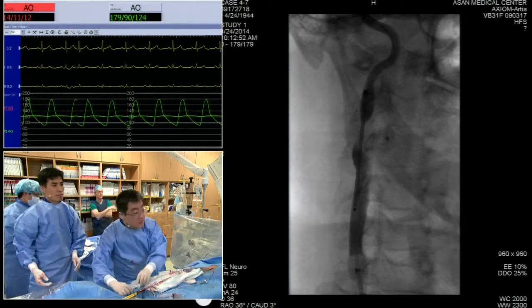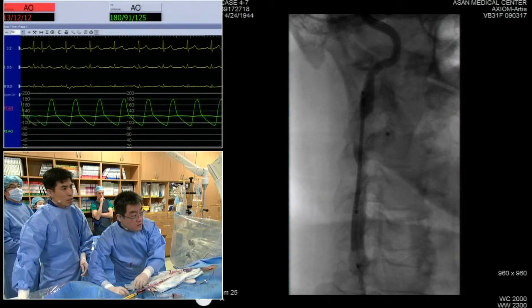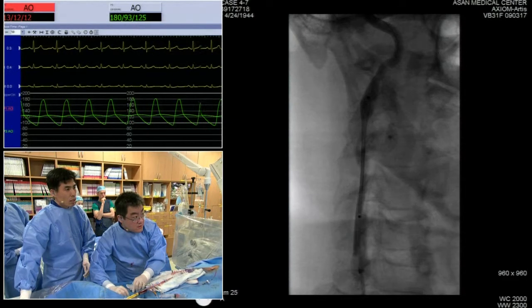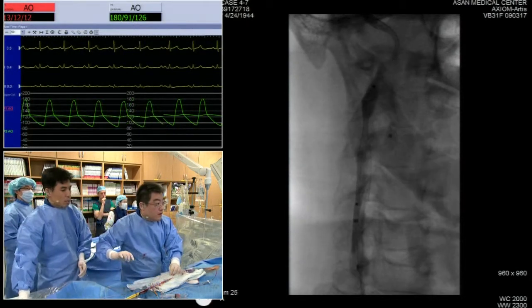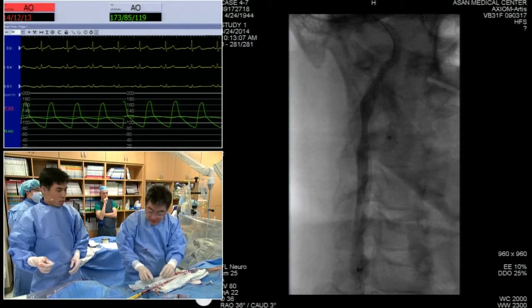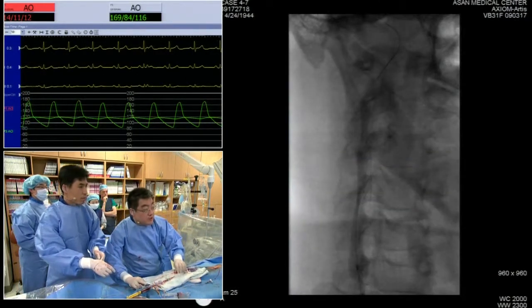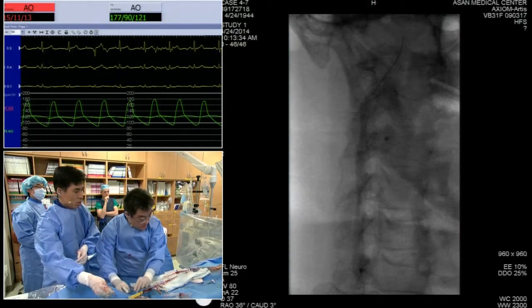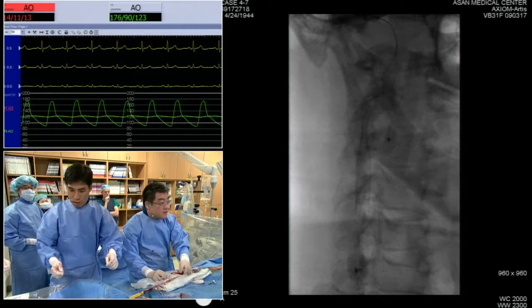So this is direct stenting without predilatation. Which type of stent? It's a carotid Wallstent 9x30. So you don't routinely do the predilatation? No, because I think the Carotid Wallstent is a very good one. With a very tight lesion, it will cross most of the time. And especially if we are using occlusive type of protection, you really want to save the procedure time and also minimize the ischemic time. So you don't use any flow reversal technique, just clamping. Just clamping.